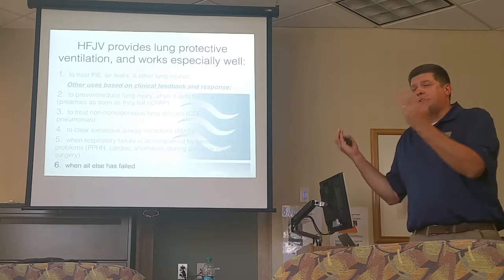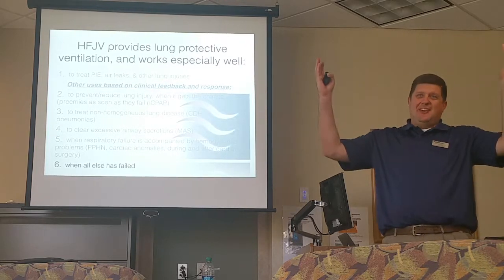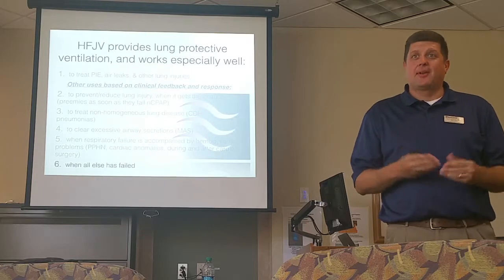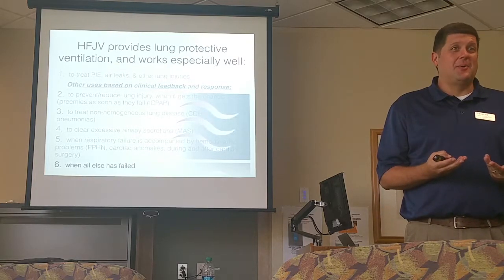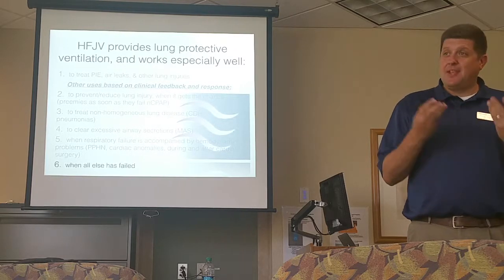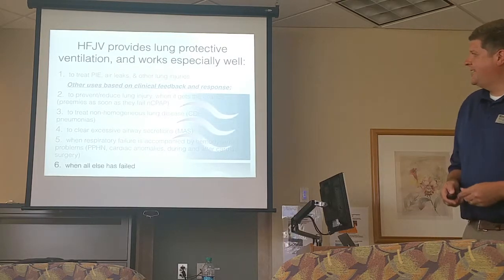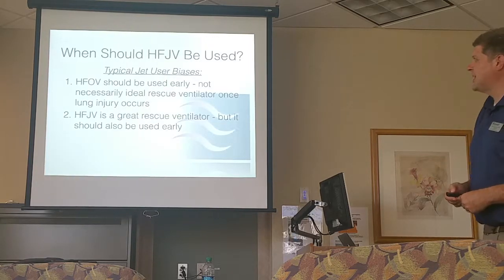And then number 6, when everything else fails and we don't know what the hell else to do, pull out the jet, okay? Because it is so different than everything else out there, it can work, it may not work, but we're not going to know unless we try. I've seen it, and I think you guys here have too. I've seen it work on kids that were just really, really bad, and I can't explain why, but it just did, so it's always worth a shot.